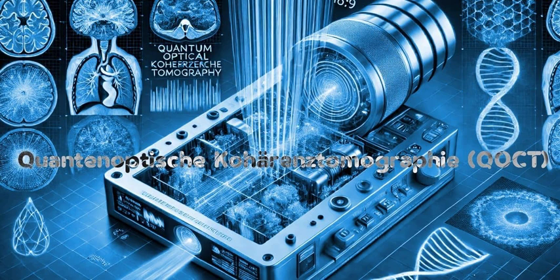It sounds incredibly sophisticated. Powerful, definitely. But I imagine it's not without its difficulties. The essay mentions some challenges. Oh, absolutely. Nothing this advanced is easy. One big technical hurdle is still the efficiency and stability of those entangled photon sources, making pairs reliably at a good rate without fluctuations. It's tough. It depends a lot on the quality of those nonlinear crystals. And the detectors. Those single photon detectors sound specialized. They are. Highly sensitive, yes, but also can be quite expensive. That's a practical bottleneck for making QOCT systems more widespread.